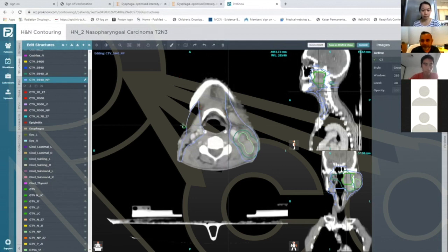I don't know if it's shipped. You can erase when it's red by clicking. Oh, there we go. Okay. Or if you hold down, I think, Control or Option when you click. Yeah, there you go. Okay.